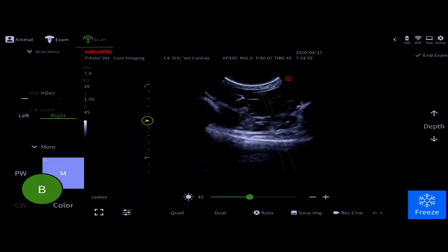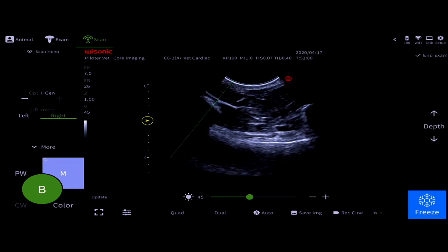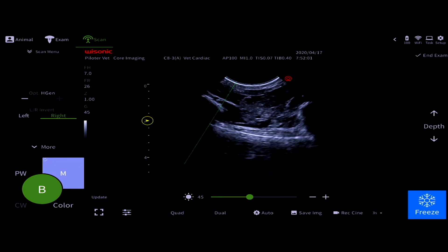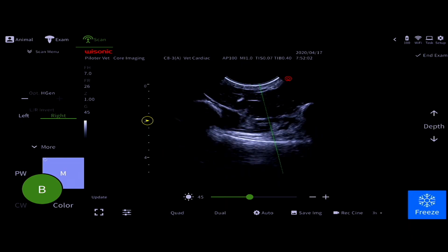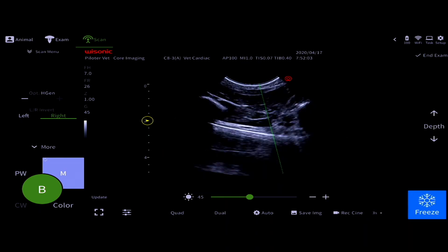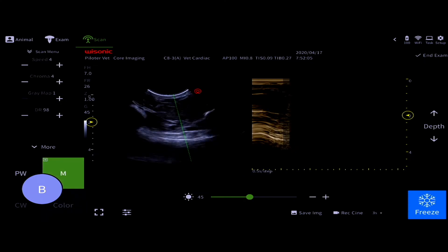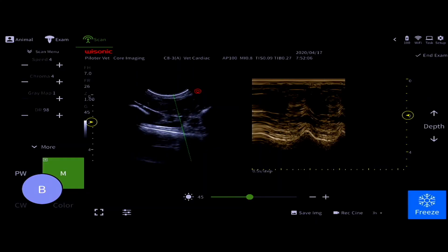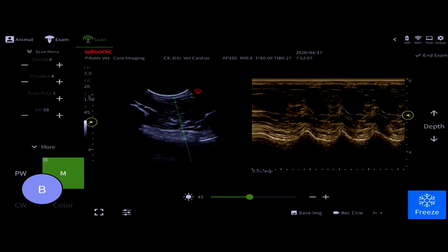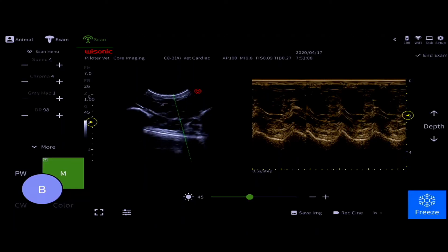Your cut line will appear and you can slide that across your image to wherever you need it to be. When you have that in place, hit M-Mode again and your M-Mode display will appear.